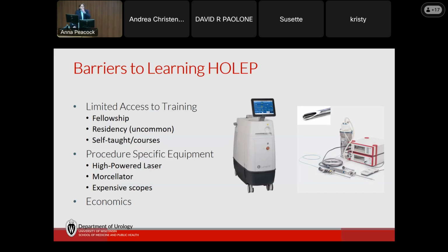I talked briefly, though, there really is limited access to training, though it's improving as HoLEP's popularity increases and patients start asking for it. Programs are looking for someone to do HoLEP, which really is where you're going to have the fastest uptake, when you indoctrinate the students and the residents, and you train them how to do it properly. Learning it out in practice, though, is really hard.